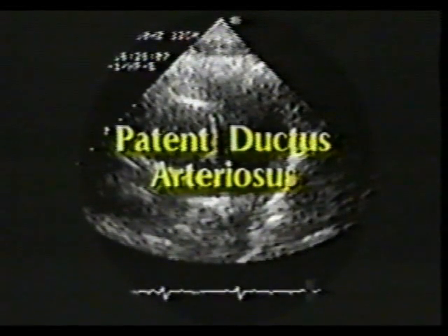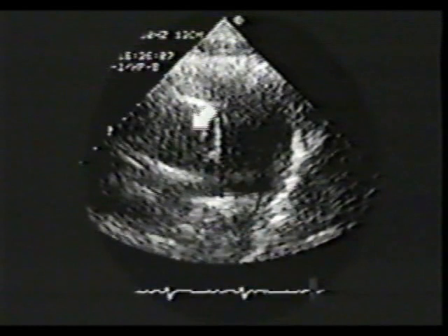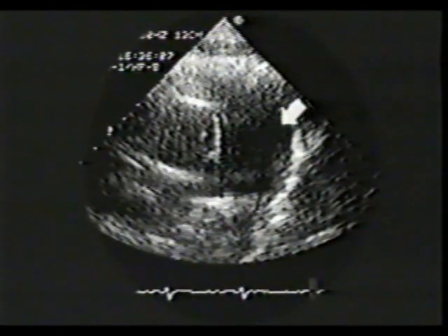Patent ductus arteriosus in the adults is very infrequently encountered and is also extremely difficult to visualize by two-dimensional echocardiography. Color flow imaging is the method of choice for directly visualizing the shunt. This is a parasternal short axis view. Here is the aortic root, and here is the mildly dilated main pulmonary artery.